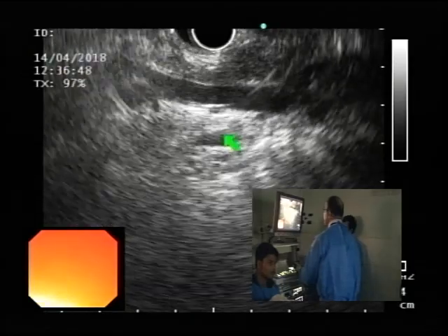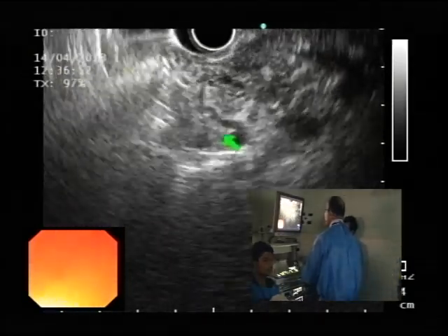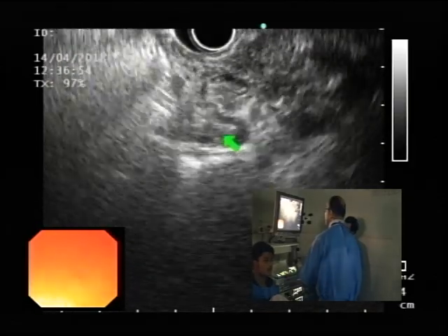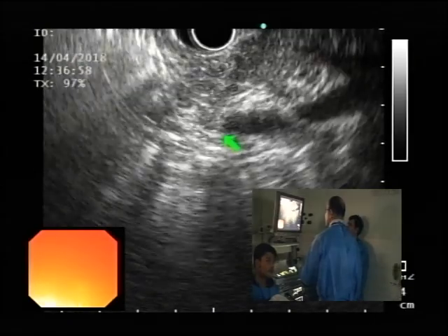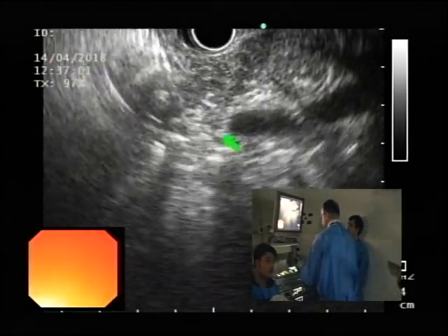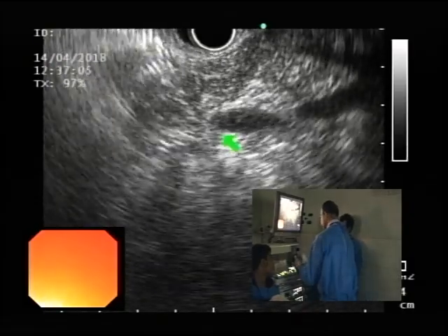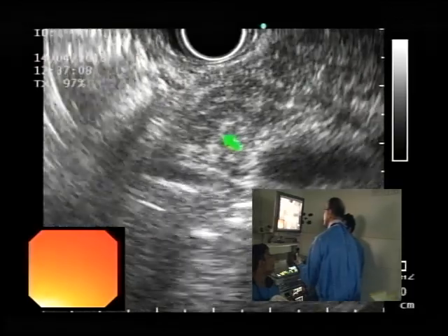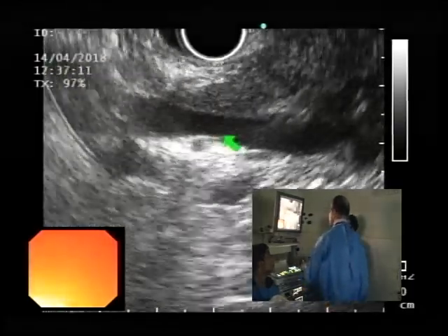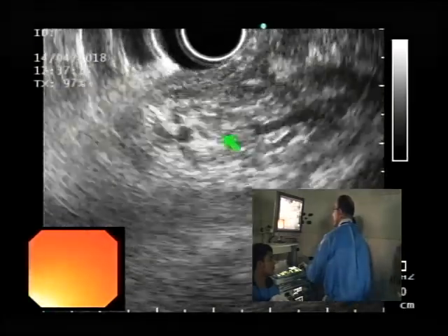So these are the mesenteric vessels, and we're starting to see the pancreas as well. Now we have the PD, I believe, in view. Dr. Saad is saying he has seen the papilla, it's not fish mouth. Okay, good to know. In this situation, I like to get closer, though I think we may lose resolution on this, just to evaluate the pancreas.